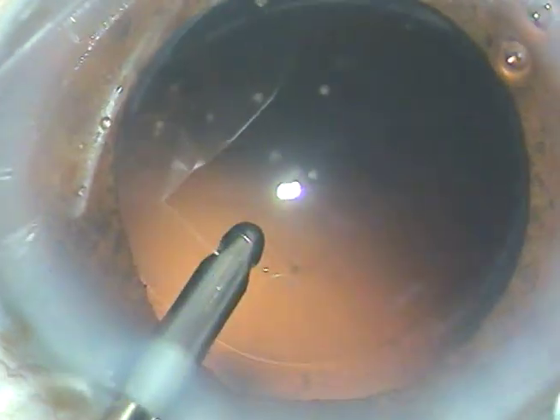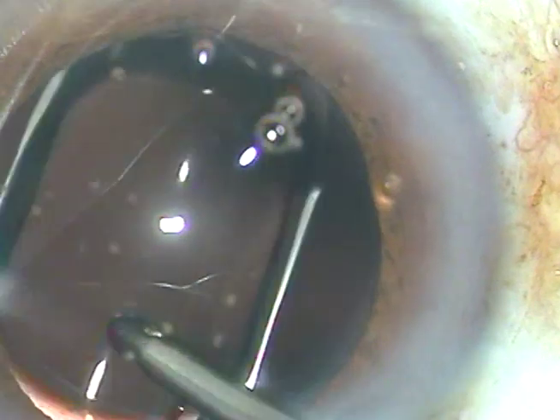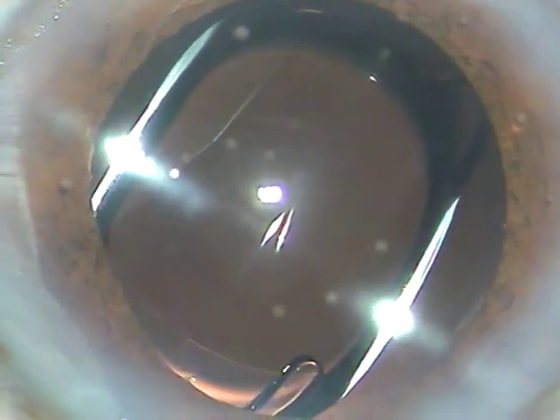I use irrigation to dislodge these cells. Now a single-piece intraocular lens is implanted in the capsular bag under irrigating fluid. The irrigating fluid keeps the anterior chamber formed and the lens goes into the capsular bag.